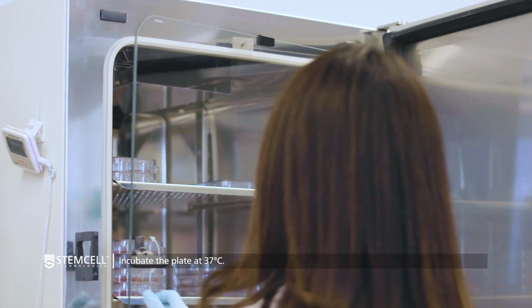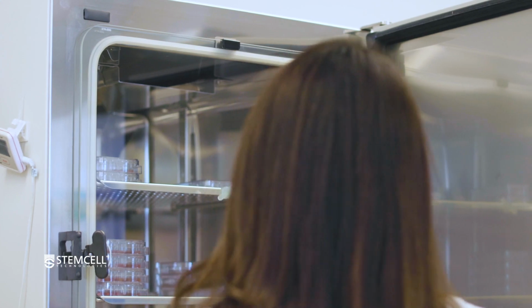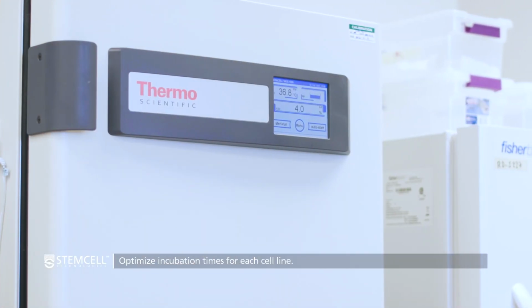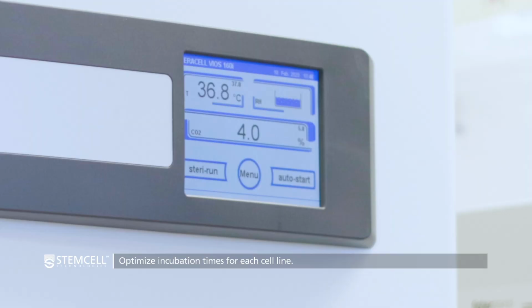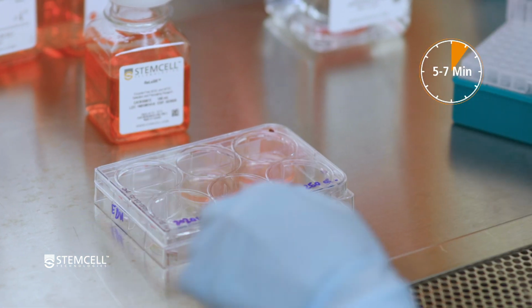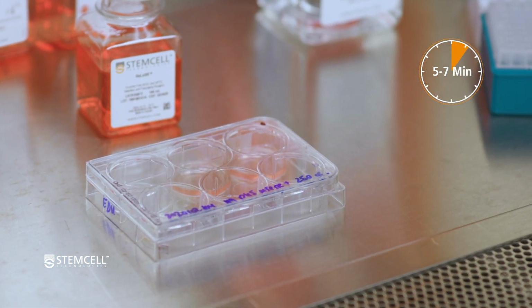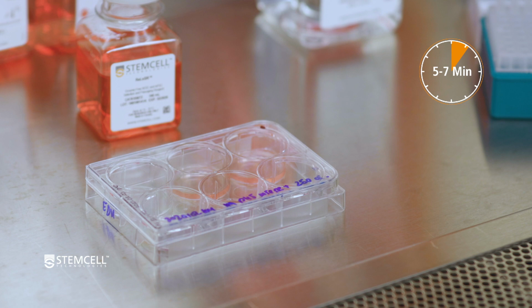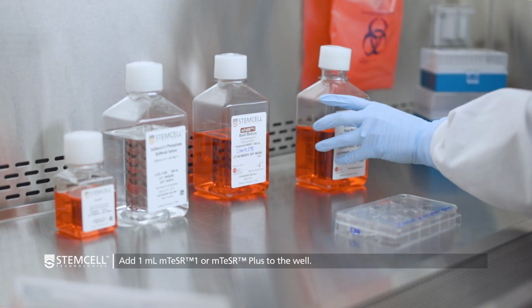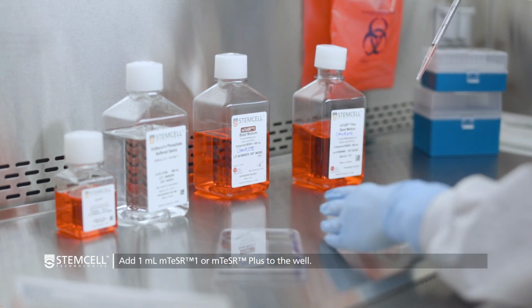If transitioning from a medium other than mTeSR1, this step may have to be altered. Incubation times will need to be optimized for each cell line to ensure that areas of differentiation are not brought forward to the next passage. If you find areas of differentiation are being brought forward to the next passage, reduce the incubation time by 1 to 2 minutes.